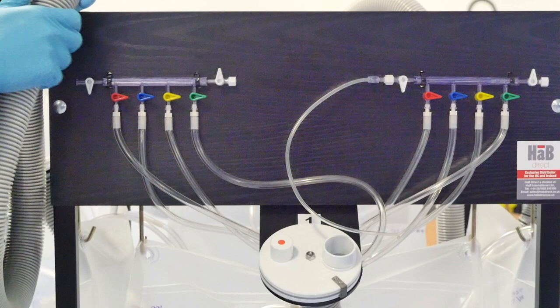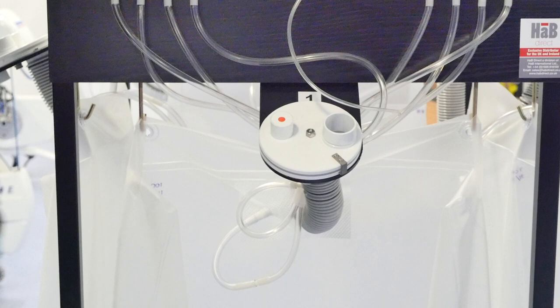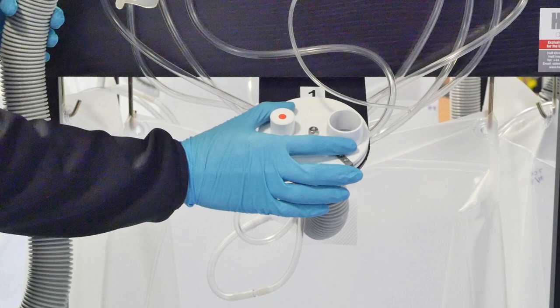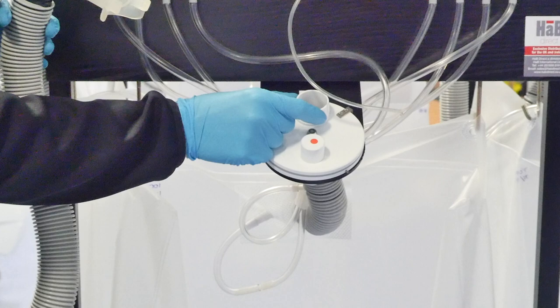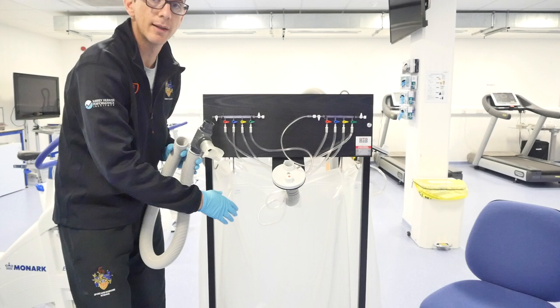This disc has two positions. It's currently open - as you can see, I can put my fingers through - so when I connect the tubing, and the participant breathes in and out, they're just breathing gas out into the atmosphere. The next position: if I close this into the bag, what's happened now is when the participant breathes out, it's connected to this tube here, which goes into the bag. So all the gas that the participant is expiring goes into the bag, and we know this is sealed, and it will store all our gas ready for analysis.